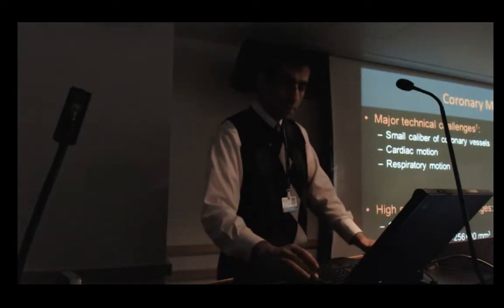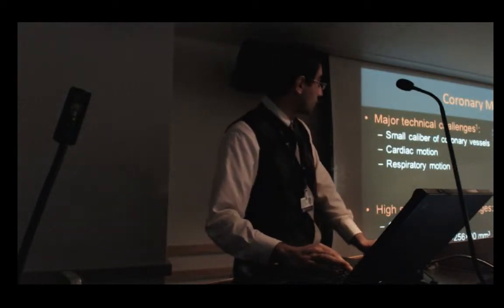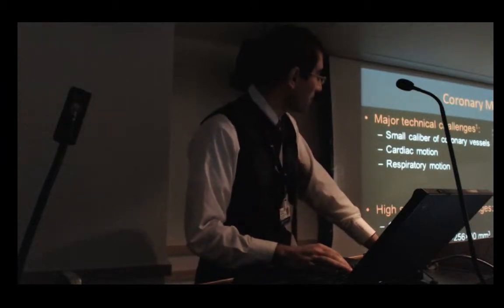Two minutes is a long time because I'm going to have cardiac motion to suppress. That's the kind of motion that we are looking at, representing the cardiac, if it's going to play correctly. Yeah, hopefully.